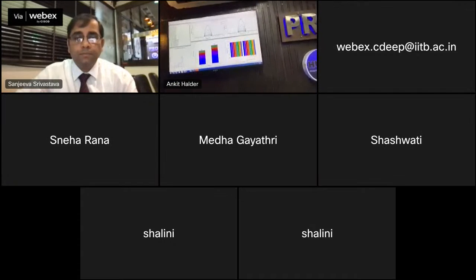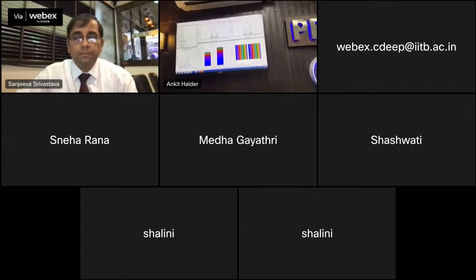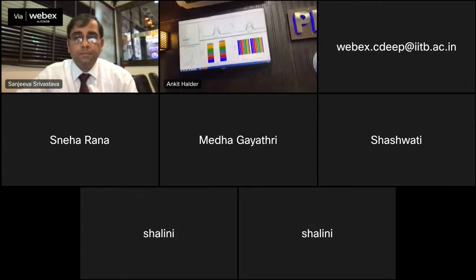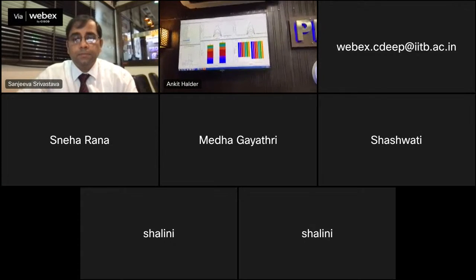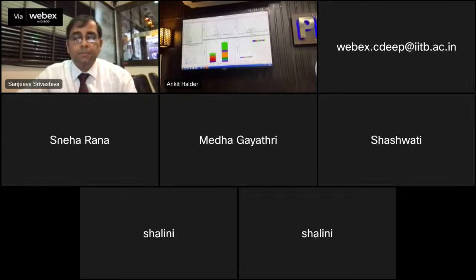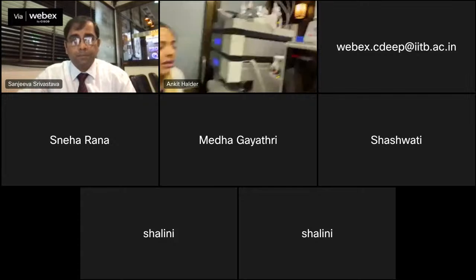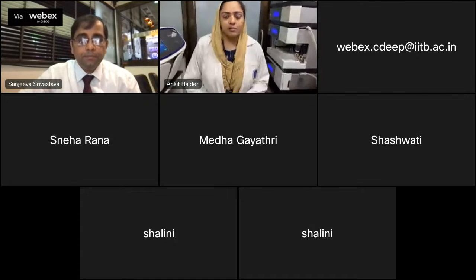Here we can see that for this particular peptide, in the sample on the left hand side, the abundance is less than in the sample on the right hand side. So this way we can perform a comparative analysis of target proteins or peptides using this kind of setup. And then again we have some spectra which look like this, which we can say are not good peaks. So based on our observation as well as the software, we pick up the peptides or the peaks which are best, and then we perform the further analysis using this software. This was an overview of an MRM experiment using a triple quadrupole.